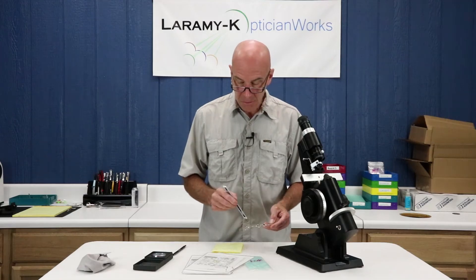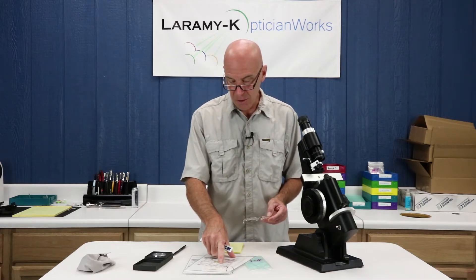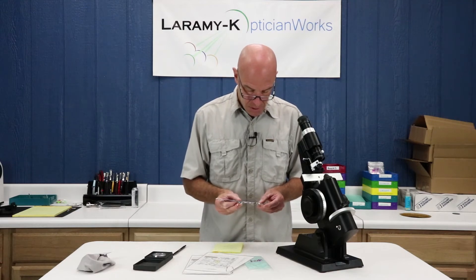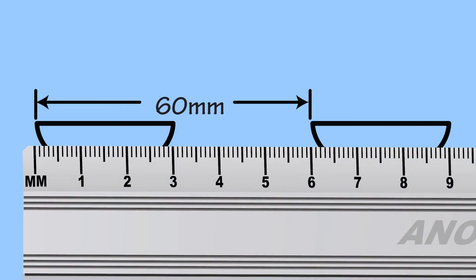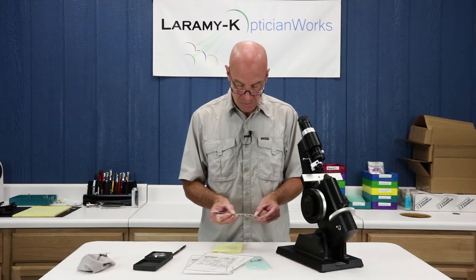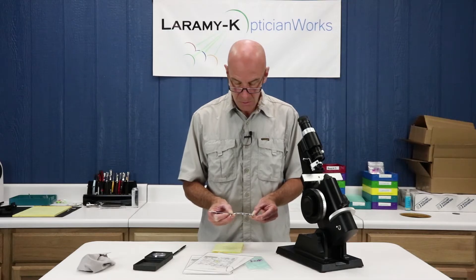Then I'm going to measure my near PD — that's the second number. My distance is supposed to be 64, my near is supposed to be 60. I do that by measuring from the inside edge to the outside edge of my segment, as shown on screen, and it is supposed to be 60. I've got about 60.5, which is certainly well within tolerance and what you would expect. So we're good there.